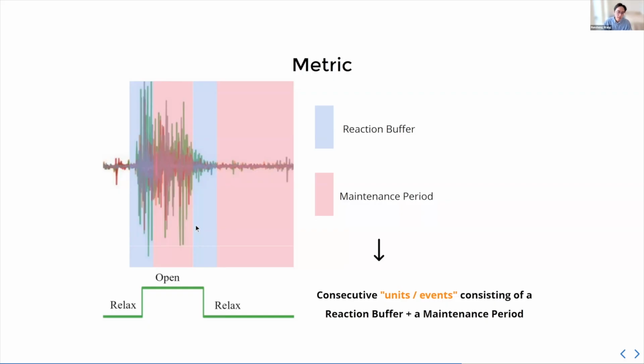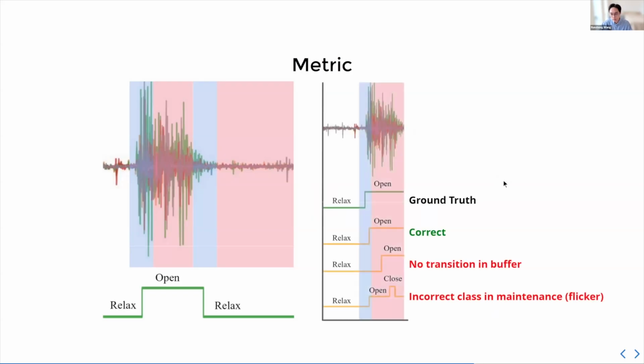And now we can evaluate the online performance of our model using this kind of event or unit-based approach, where it is only a good prediction if it is fast, meaning that it lies within this reaction buffer, and that once it transitions, it is very stable after that. It does not make wrong predictions, right? So there are no flickers. Some examples of this you can see on the right: you see the ground truth on the very top.